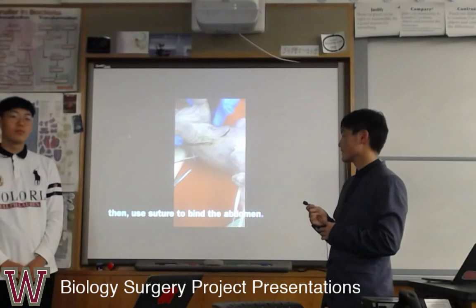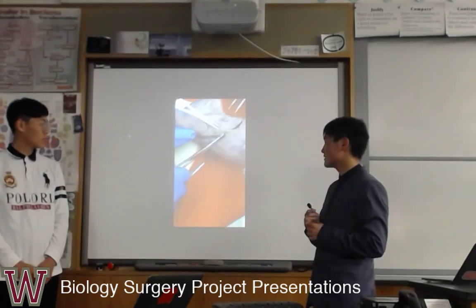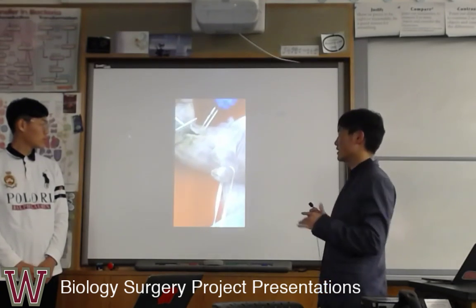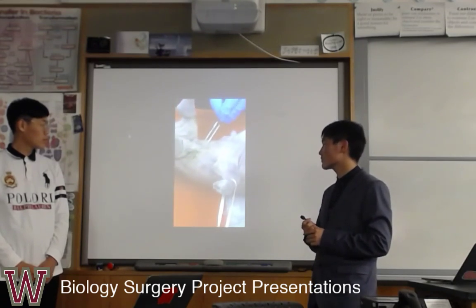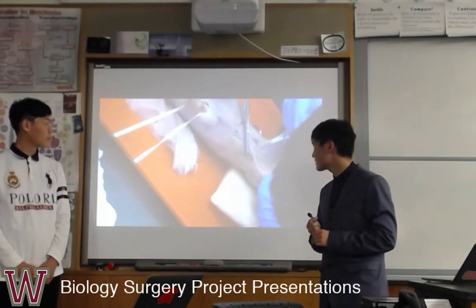For the final step, we use the suture to close the abdomen. And this is the final step of the surgery, the stitching of the wound on the stomach. And this is the final.